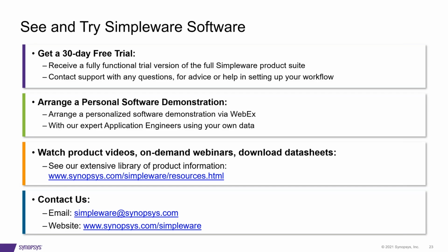Yeah, so a few coming in. So the first one we've got here, can you explain how the workflow can be automated? Yeah, so I guess I can take that on.